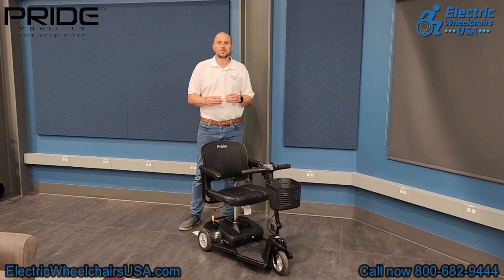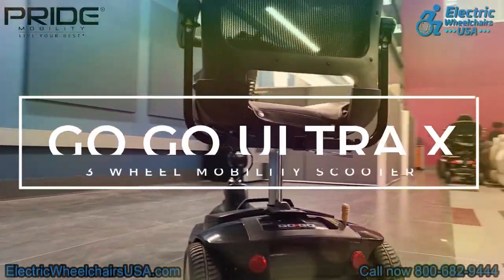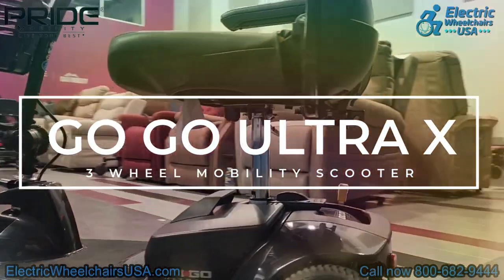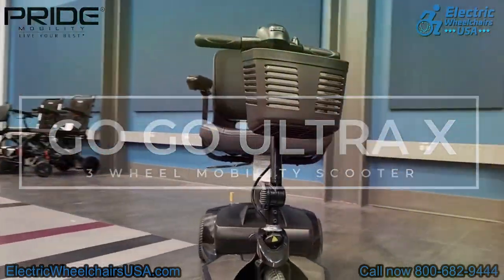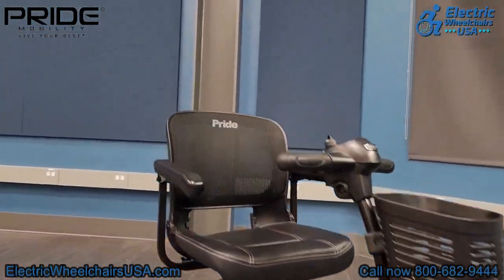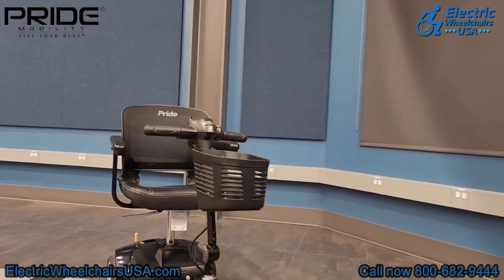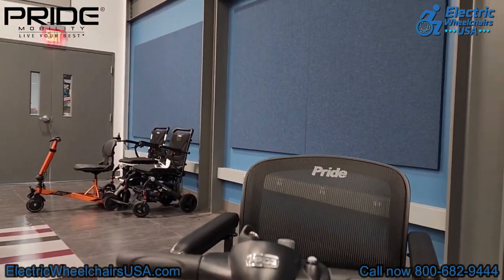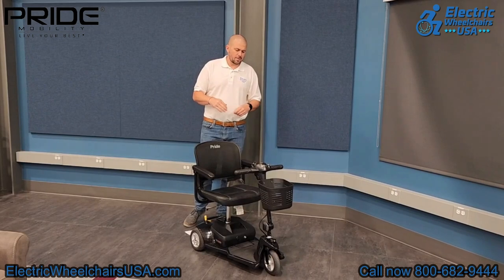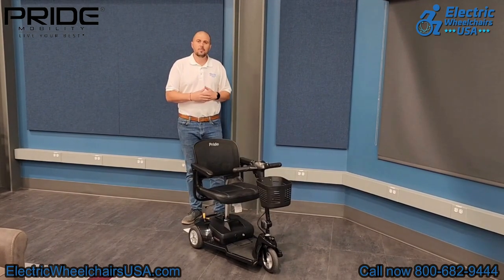Welcome to the Electric Wheelchairs USA Mobility Experts channel. In today's video, we're going to talk about the Pride GOGO Ultra X 3-wheel mobility scooter, model number S39. This is a practical and portable mobility scooter that breaks down into more easily manageable pieces. It can support up to 260 pounds and is a great scooter for someone that just needs simple mobility and doesn't want to break the bank.